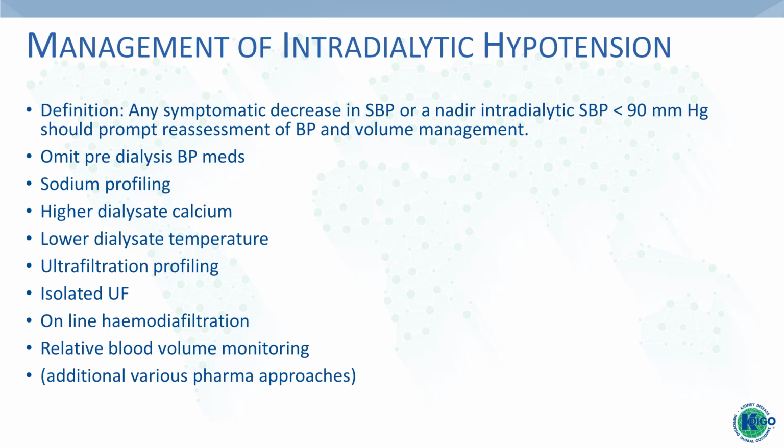This feedback regulates the sodium and the ultrafiltration profile, such that during the first half of the dialysis session, the sodium profiling prevents a sharp fall in plasma osmolality and therefore increases the plasma refilling rate.